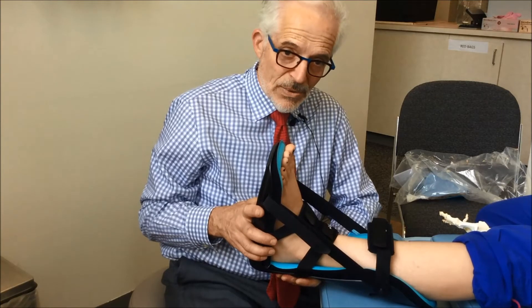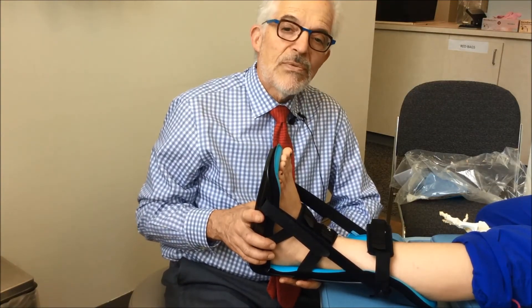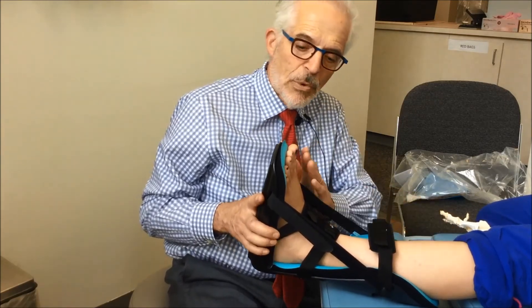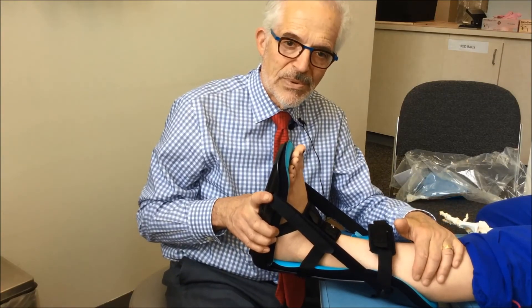If this is done regularly, daily, within three to four weeks' time, our patients are able to increase the range of motion of their ankle and stretch out their calf muscle effectively.